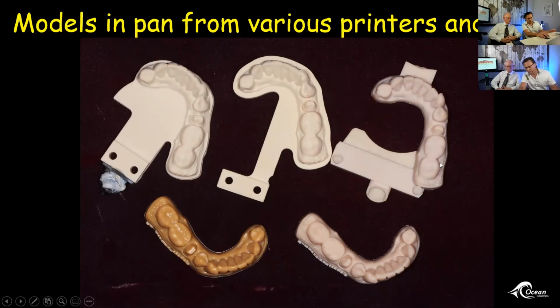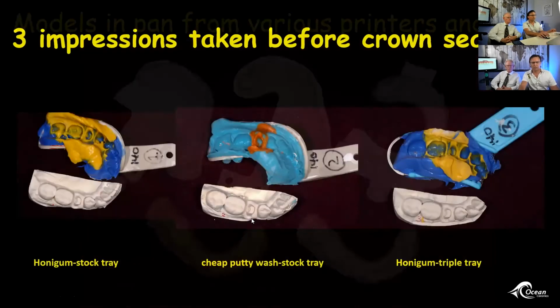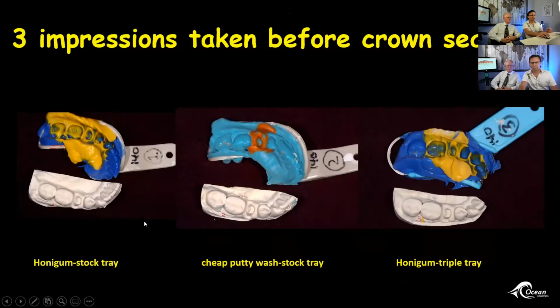This is, I think, an Asiga Max model. And I think this is a Carbon. And this was some knockoff printer that we used to work with at the very beginning, but we don't anymore. So these are the 3 impressions that Steve took before he seated the crown.